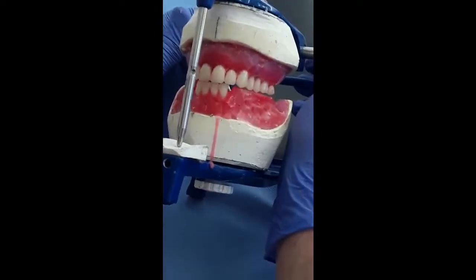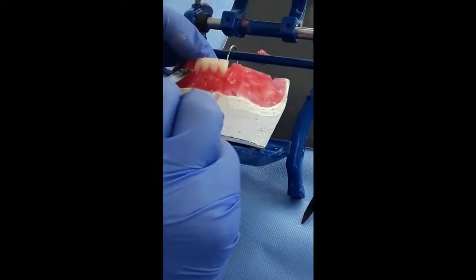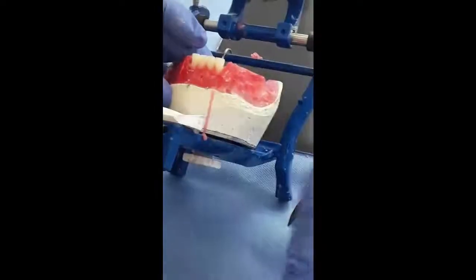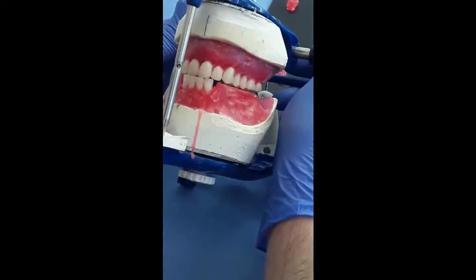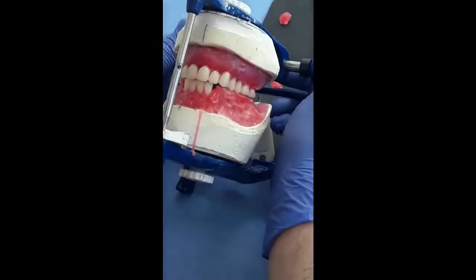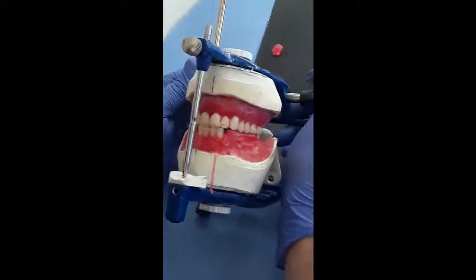I evaluate the incisal guidance angle created for the lateral. I can raise it a little bit. We have enough space here. Now you can see that I can achieve edge-to-edge contact, brushing contact, without separation of the pin and without movement of the teeth, as they are mechanically protected by the movement of the incisal pin upon the incisal guidance table.